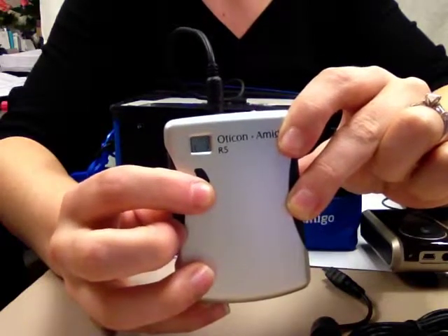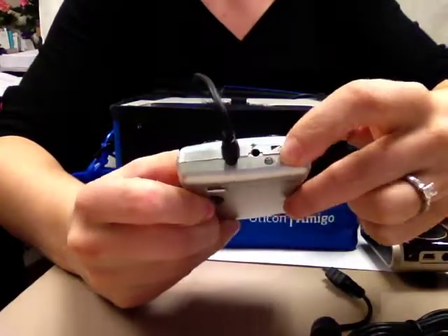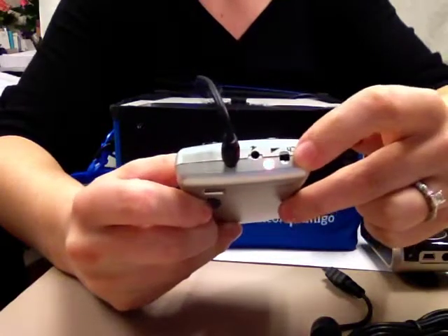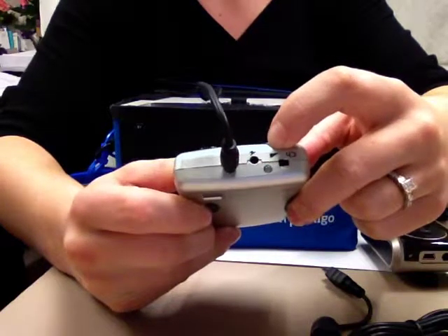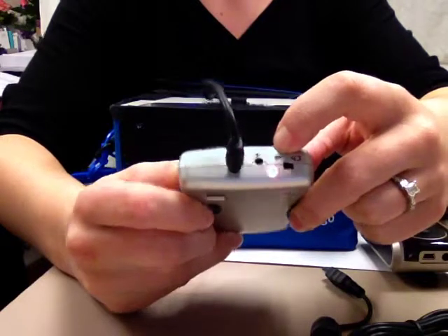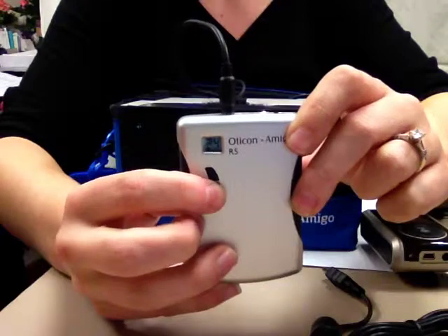If you still don't hear your voice, try increasing the volume of the Amigo Desktop speaker. To do this, slide the channel button on top of the receiver to the volume setting. This is seen as a sideways triangle symbol. Use the plus and minus buttons below the screen to change the volume.